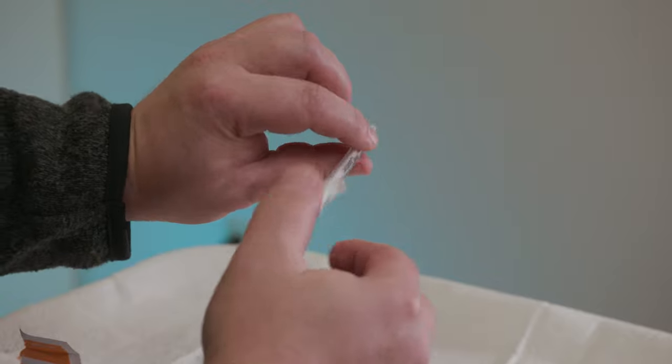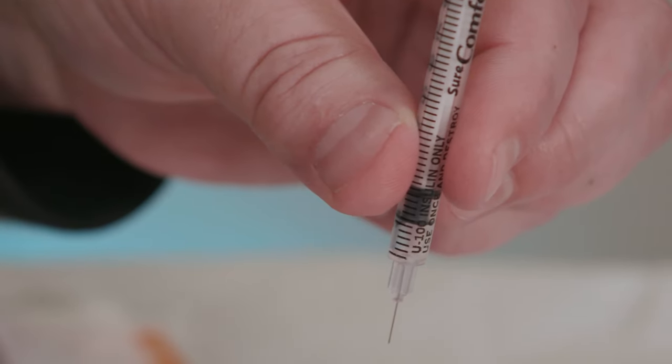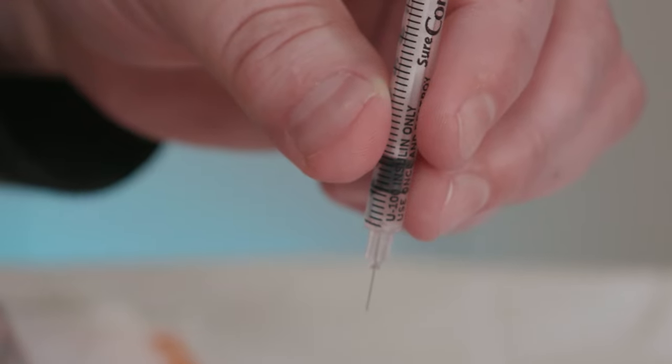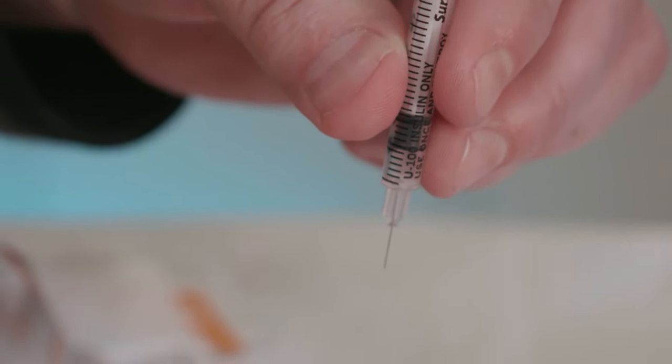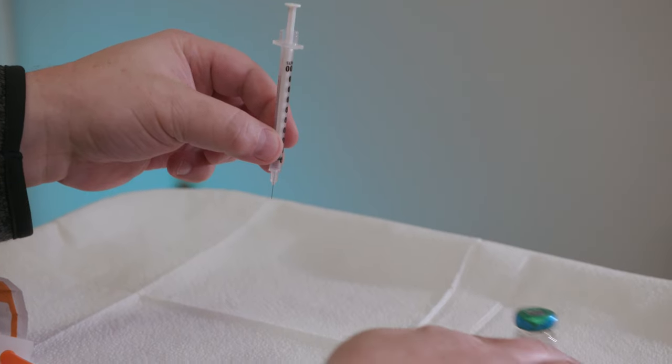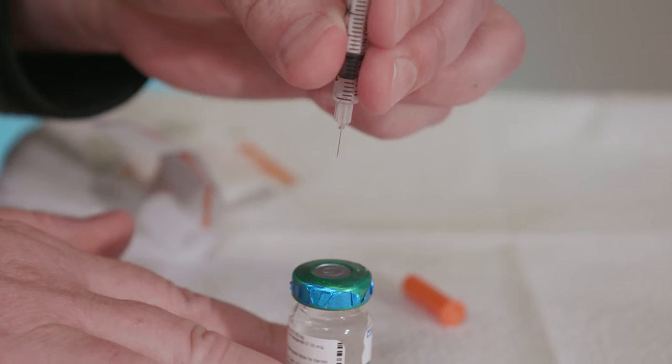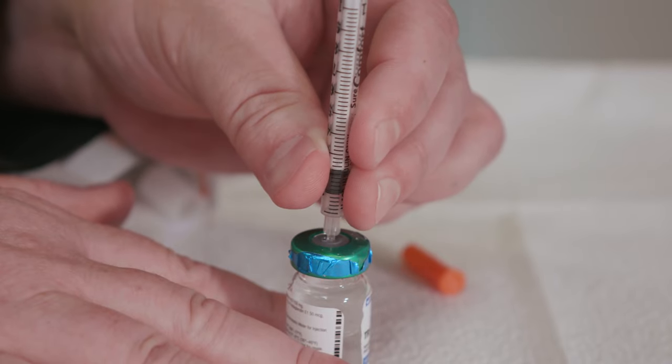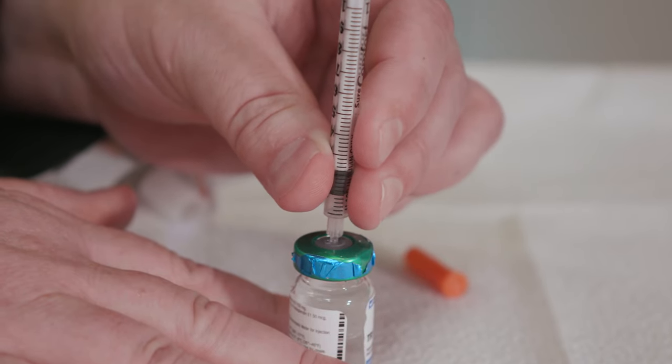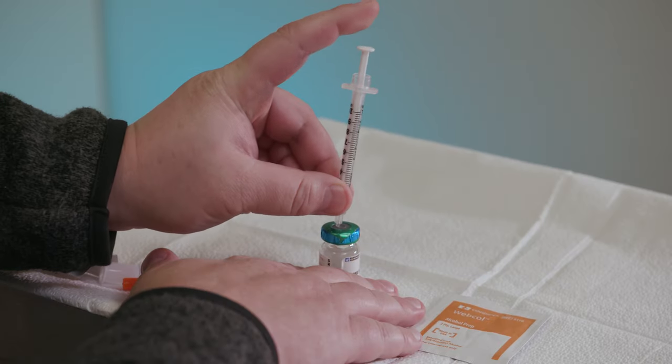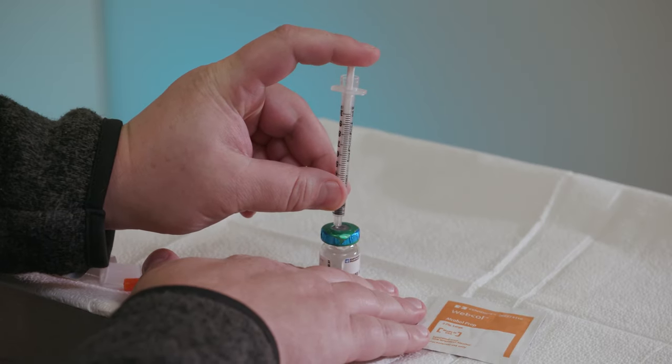Turn the syringe so the needle points down. Hold it between your thumb, index, and middle fingers, like you'd hold a pen or a dart, close to the needle. Hold the medication vial with your other hand. Put the needle through the center of the rubber stopper on the vial. The vial is pressurized, so you need to put air into it before drawing out the medication. Push the plunger down to inject air into the vial.